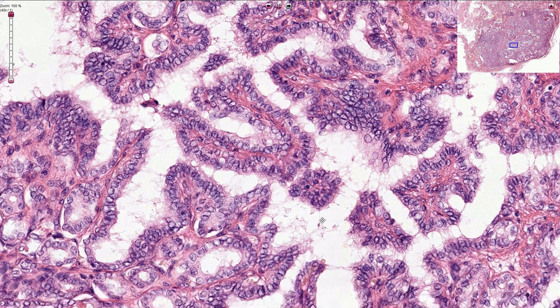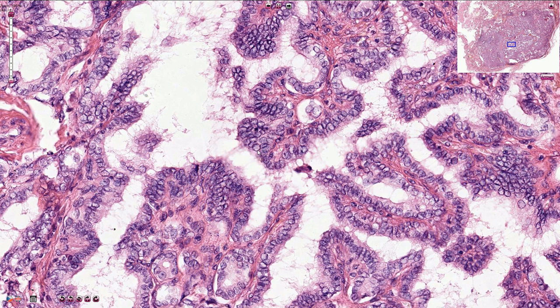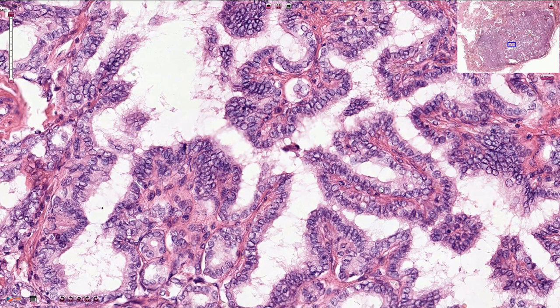Nuclear pseudo inclusions are slightly less clear in this picture, but here we can see something that looks like a small intranuclear inclusion. More important than the pseudo inclusions is the typical chromatin appearance — chromatin clearing and an empty appearance of the nuclei, sometimes described as orphan Annie nuclei, after a cartoon character from the 1920s.